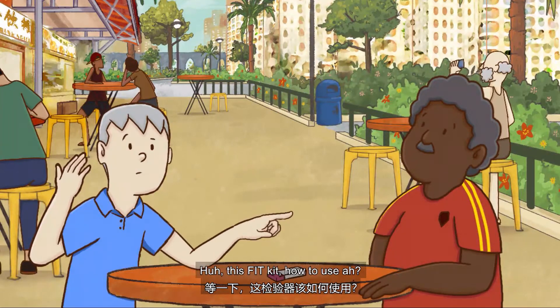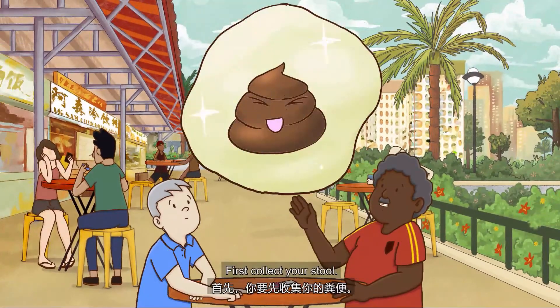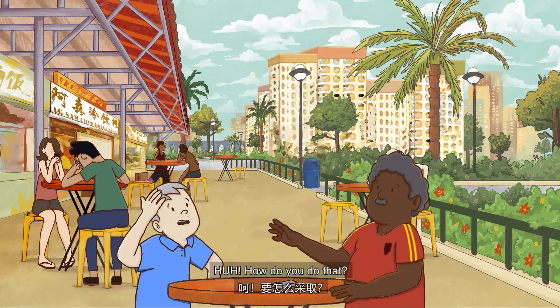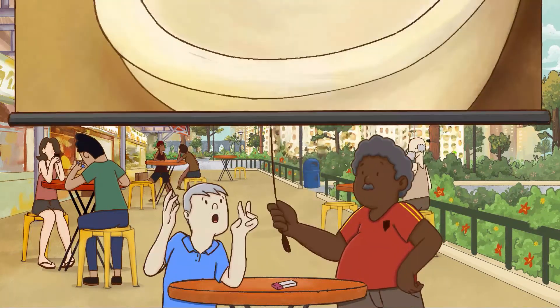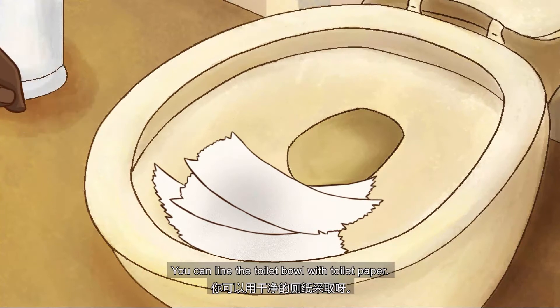This Fit Kit — how to use? Come, let me teach you. First, collect your stool. It must not come in contact with water or urine. How do you do that? You can line the toilet bowl with toilet paper. So simple!